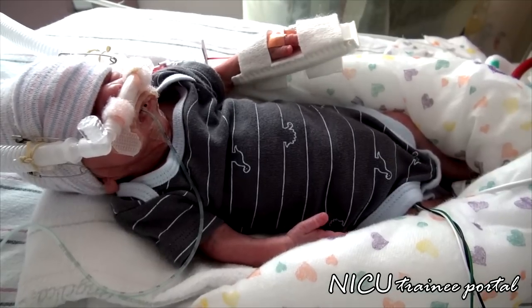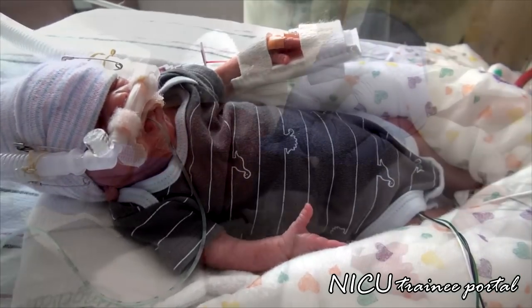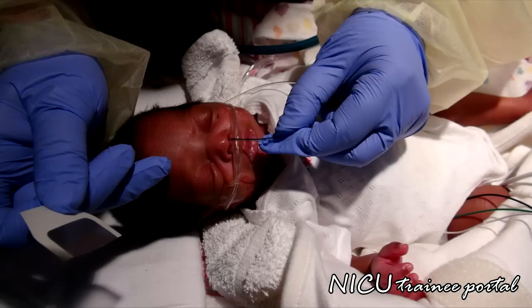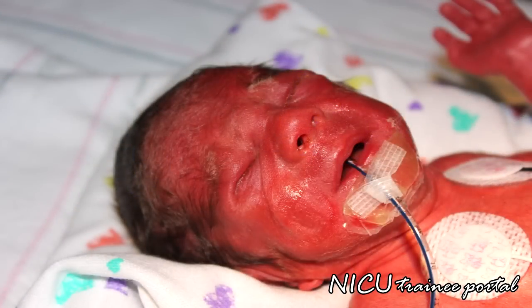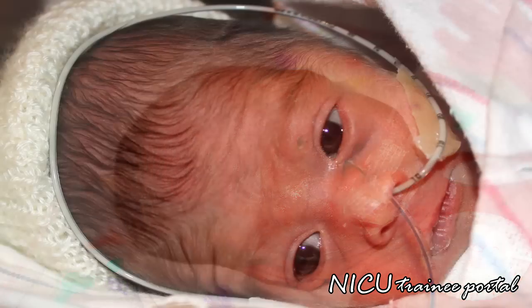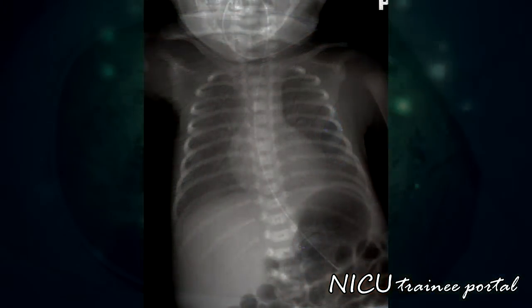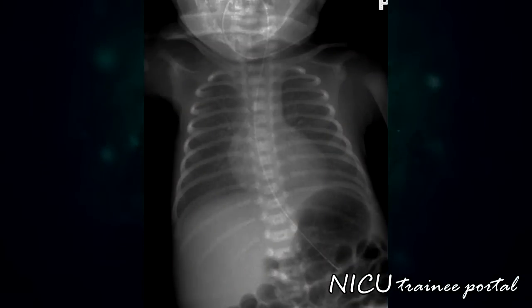A gastric tube is a single-lumen synthetic tube that is passed from either the nose — a nasogastric tube — or the mouth — an orogastric tube — into the stomach. It is incrementally marked in centimetres and is radio-opaque to allow easy visualisation during radiography.